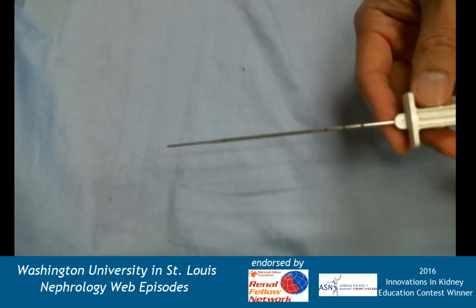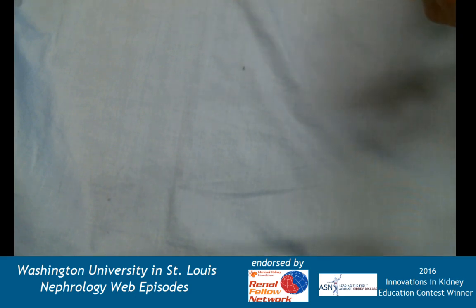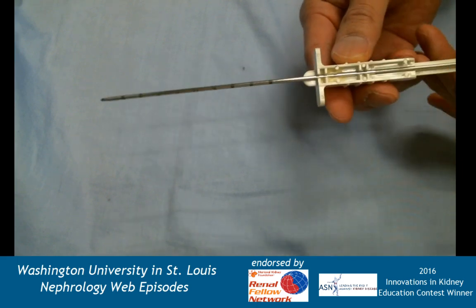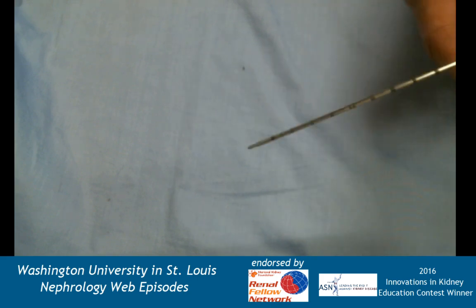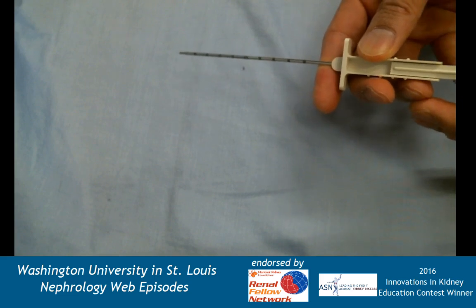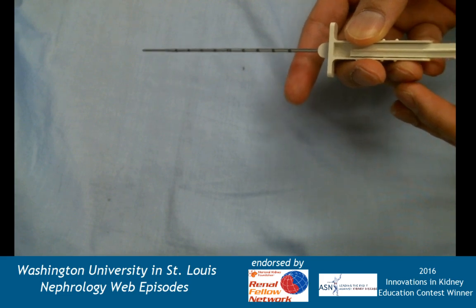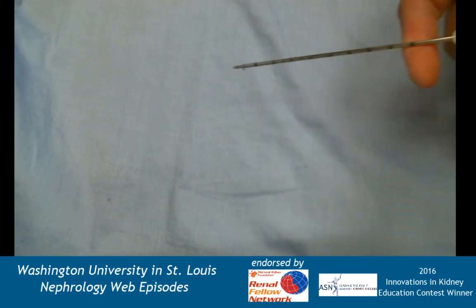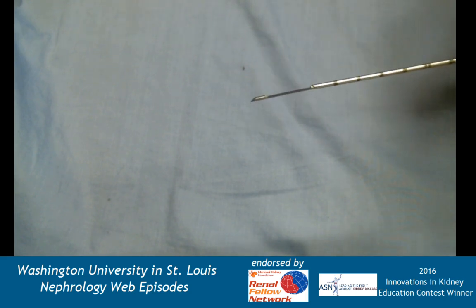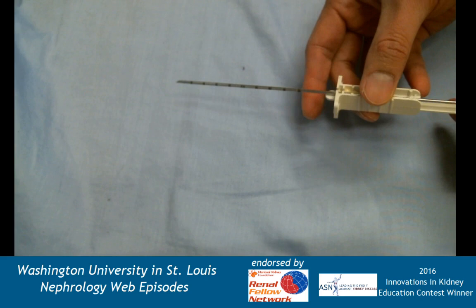After that we have the non-spring-loaded device, which looks very similar to the modern biopsy gun. Here it is in its retracted position — you can see markings for centimeters so you can gauge depth. This is not spring-loaded, so you would be at the level of wherever you wanted to take the piece of kidney, punch forward manually, then push forward the outer sheath, remove the entire piece, and pull back to look at the core.